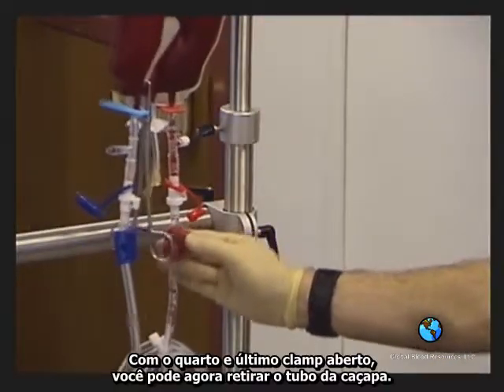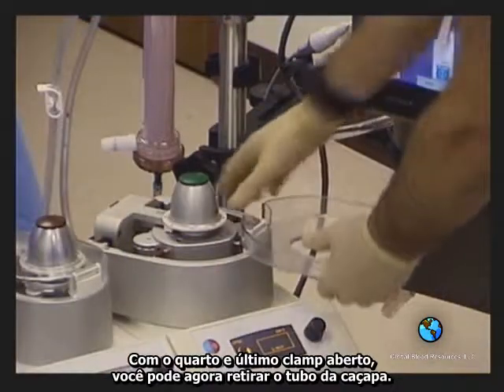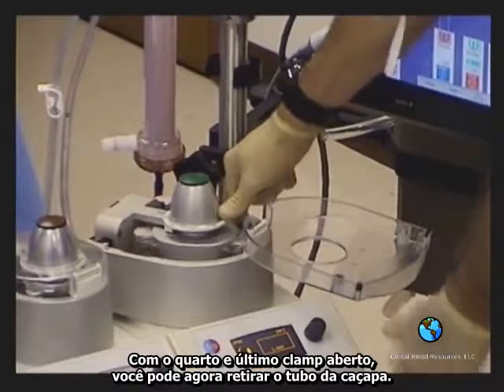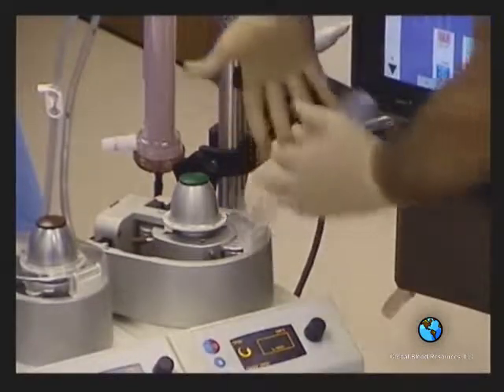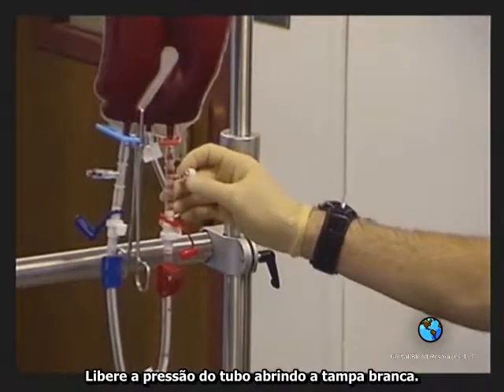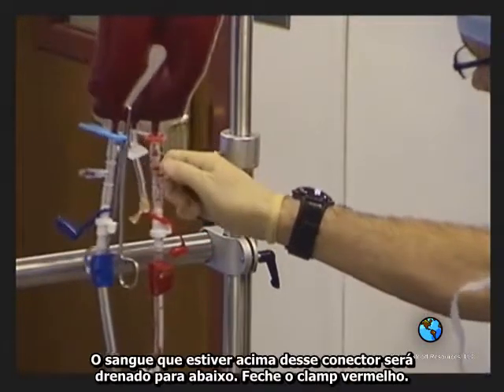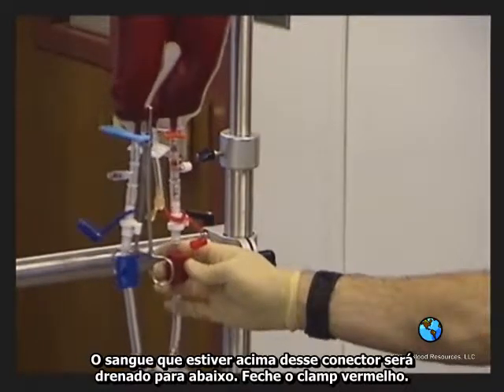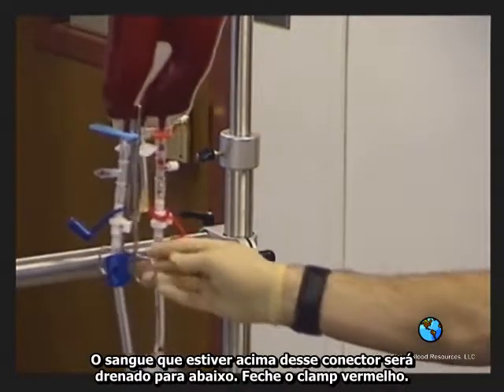With the 4th and final pinch clamp open, you can now open the roller pump and turn it backwards to create a negative pressure in the tubing. Release this pressure by opening the white luer cap. Blood above this connector will be sucked down below the red pinch clamp, which is the last one to close before removing the tubing clamp.